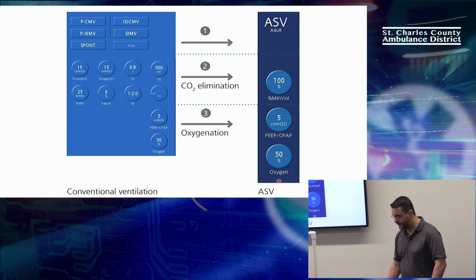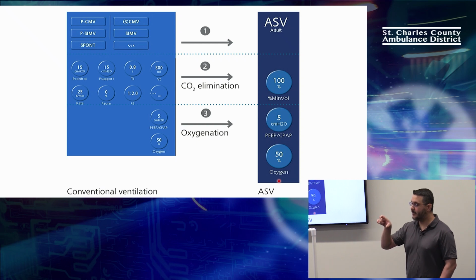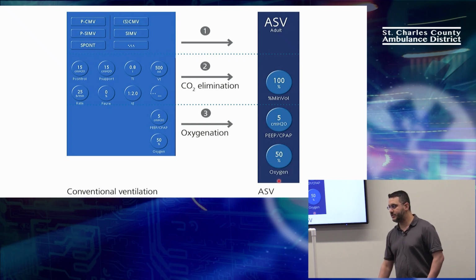What's a safe FiO2 we said? 50%. Can you do 100? Yeah, you can do 100. You're fine. But we try to ramp that down, okay? So this is what I was talking about earlier. You were asking me about PEEP. If I think they have some kind of atelectasis, mucus plugs, a bunch of mucus in the lungs, pneumonia, a reason to need PEEP, I increase the PEEP, okay? I don't always increase the FiO2 unless I think they just need FiO2. So if someone has any kind of pneumonia-ish, we tend to err around a PEEP of 10 or so, like that area.